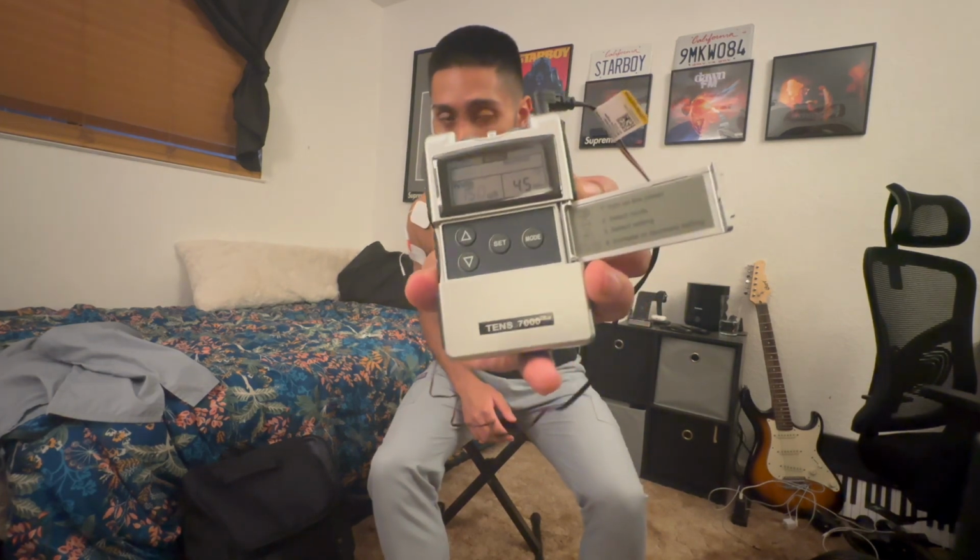I'll go ahead and turn the device on. And I'm going for the acupuncture treatment because of it being a chronic issue. So I'll start my pulse width over at 150. So we can be at the lowest width setting for right now. And we can obviously adjust that mid-treatment. And then my rate will be at 2 hertz. Just to show you again, here's my width at 150. And then my treatment time, obviously we're not going to go through the full 45 minutes.